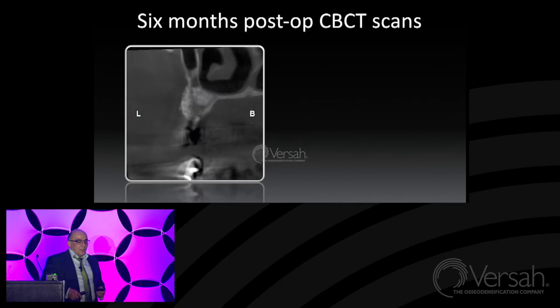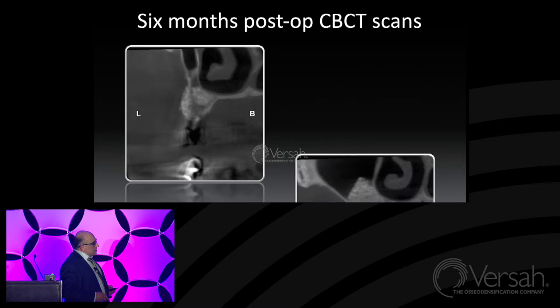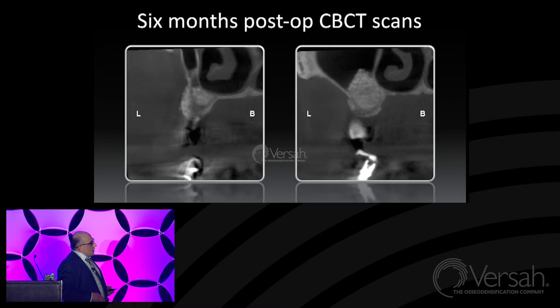Look at the initial amount of bone, here it is. That's the grafted part in the sinus and from outside and inside, from palatal and vestibular side of the ridge, is the zone of the second premolar. And look at the initial amount of the bone at the zone of the first molar, barely 1 millimeter of the bone from all sides. And that's the zone which we created using this lateral approach technique for sinus lifting.